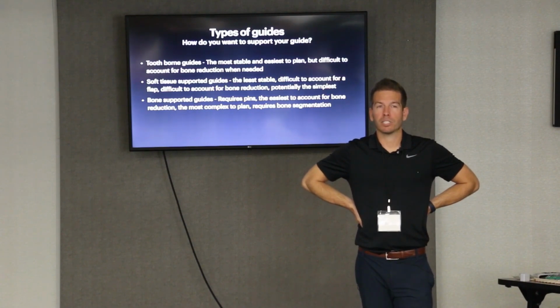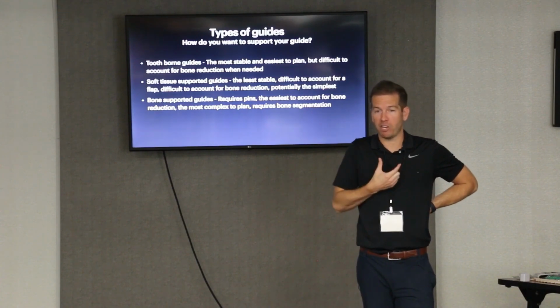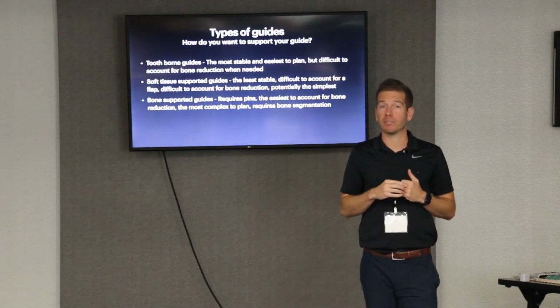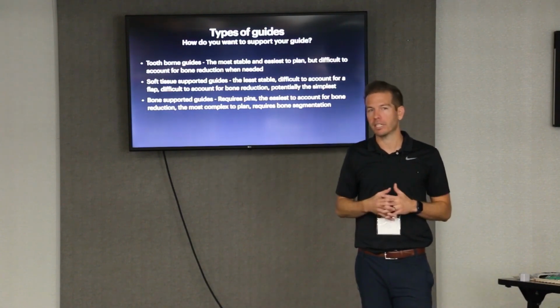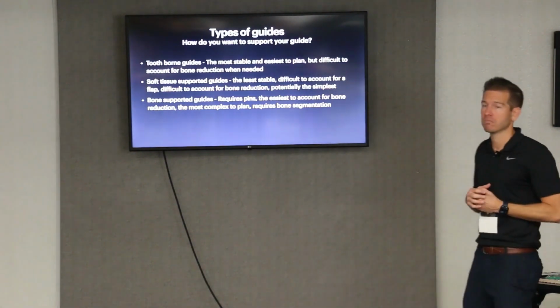Yeah, that's a really good question. I think so, because you could still use those teeth with class 1, class 2 mobility, no problem. When you fixate and 4 teeth get locked in, absolutely, I still think it's better. I wouldn't be too concerned about that. If it was just swimming, then obviously you can't use that. But most of the time, a little mobility is not going to do too much.